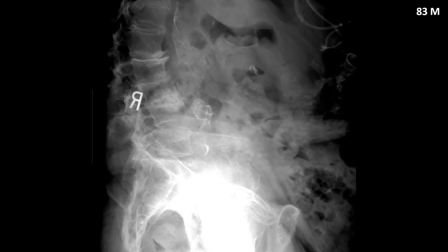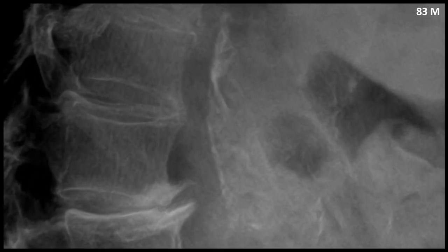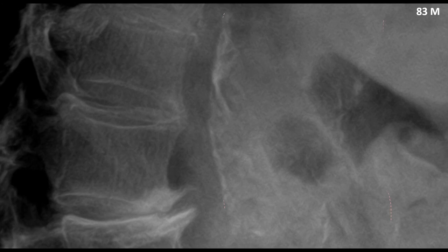This is an 83-year-old male with a host of significant clinical red flags. Zooming into the abdominal aorta, this measures greater than 6 centimeters.